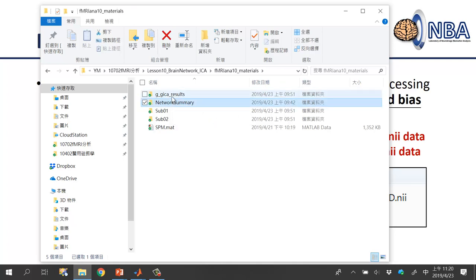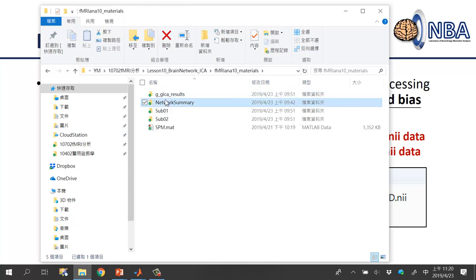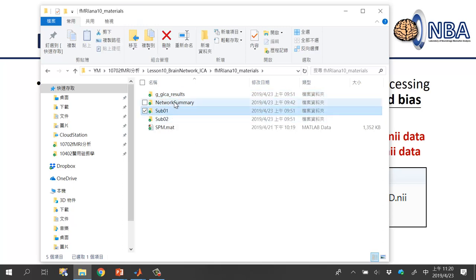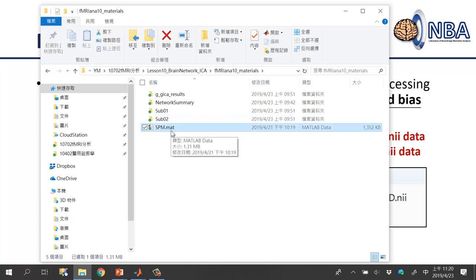The other two folders were produced by the GIFT toolbox — these are provided in case you cannot follow the tempo, but you should definitely try to produce the results yourself. The SPM.mat file is acquired using SPM's first-level model specification, and I will explain its purpose later.